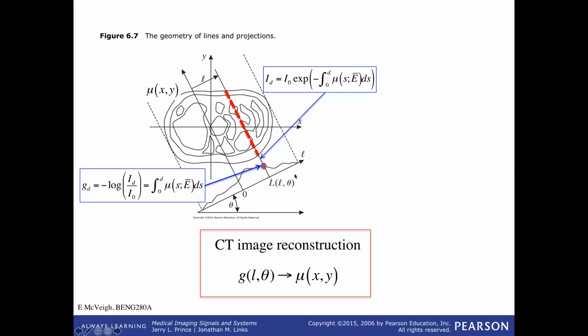And just to restate the problem, we have parallel beams of X-rays going through the patient, as shown here. Along each beam, we get attenuation of X-rays such that there's a modification of the X-ray intensity as that beam exits the patient.